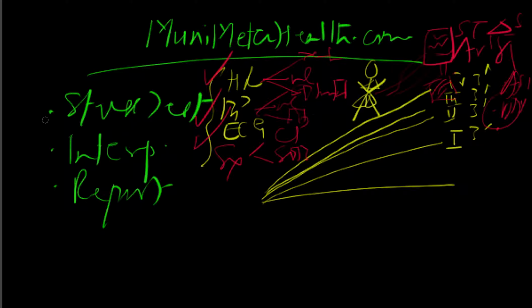Having seen these interpretations, so what is a stress test? We have understood that. How do you prepare the patient for the test to come in? We have understood that. We have seen the interpretation of the test based on these parameters that you normally like to follow, and then try to elicit these symptoms. Now, very importantly, ST changes, you have to have at least more than 1 millimeter in 2 to 3 consecutive leads. Then you call that test positive, remember. Otherwise, you may not call this test positive, and you try to elicit at least 1 millimeter and above to make that test interpretable.